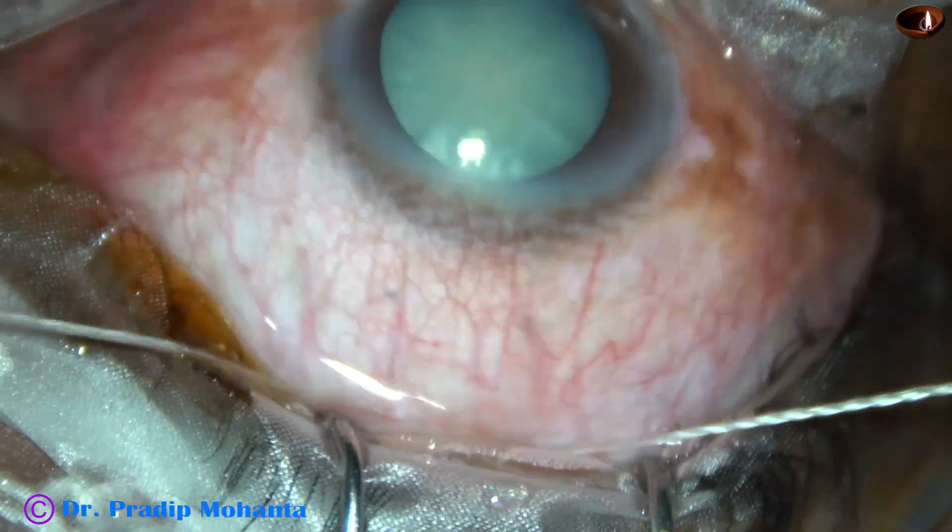After enlarging the main incision on the left side, I have made a cut at the capsule. Now I take the utrata again and complete the rhexis on the right side. This is a good rhexis with extension just in front of the main incision. The tunnel is completely open now.